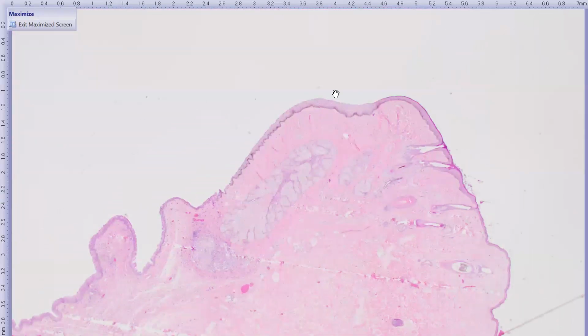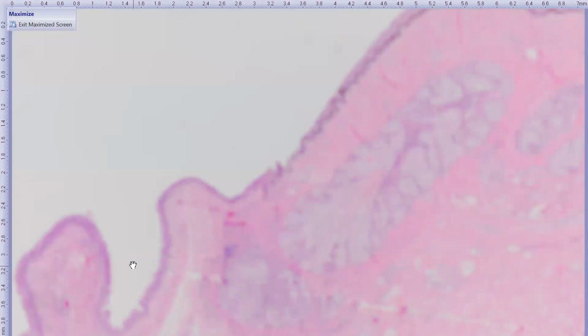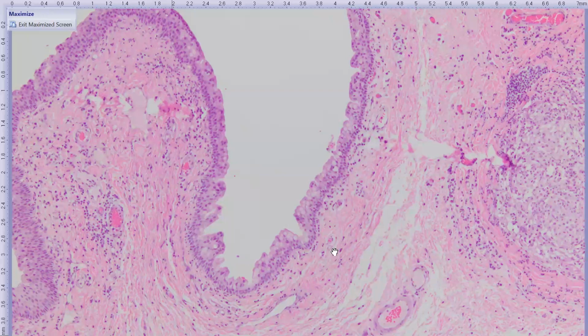So here is the haired skin of the eyelid. Here are some hair follicles. Here's the epidermis. As we follow it around, here's the eyelid margin right here. Here's my Meibomian glands. So here we're getting into the conjunctiva. This is the conjunctival epithelium. We can see that the conjunctival epithelium, as it should, has a nice population of, oh, wait, maybe I'm lying, goblet cells, hopefully in here. Yeah. So here are goblet cells in that conjunctival epithelium.